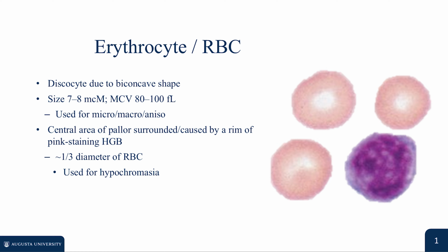to 100 femtoliters. When you are performing a microscopic examination of a peripheral blood smear, a great internal reference for size is the nucleus of a normal, resting small lymphocyte. The diameter of a standard normocytic red cell should be roughly identical to that nuclear diameter.